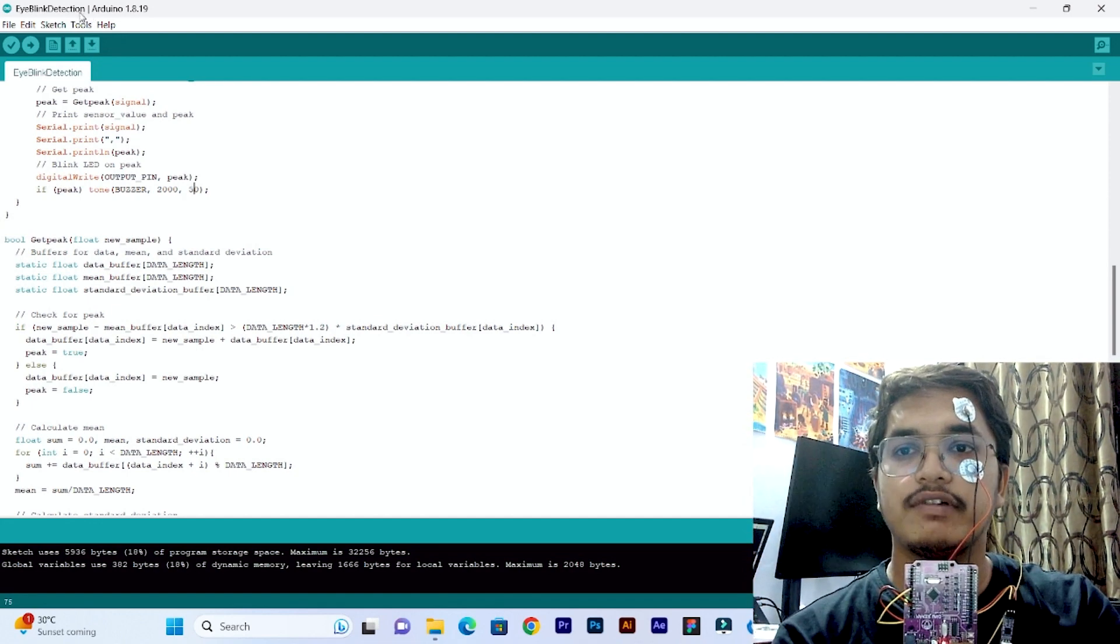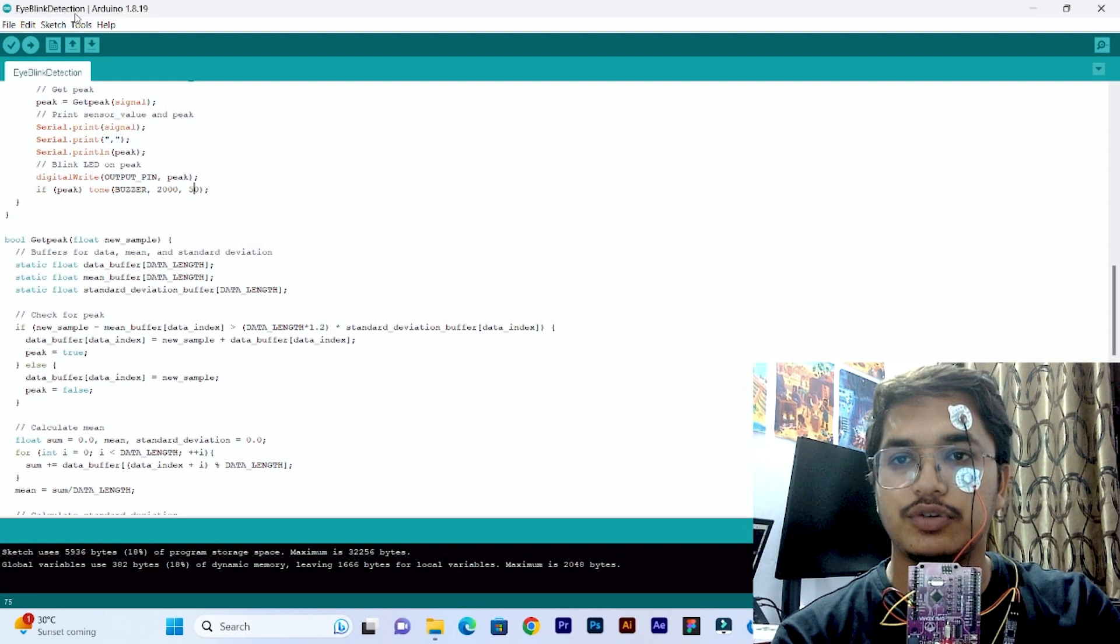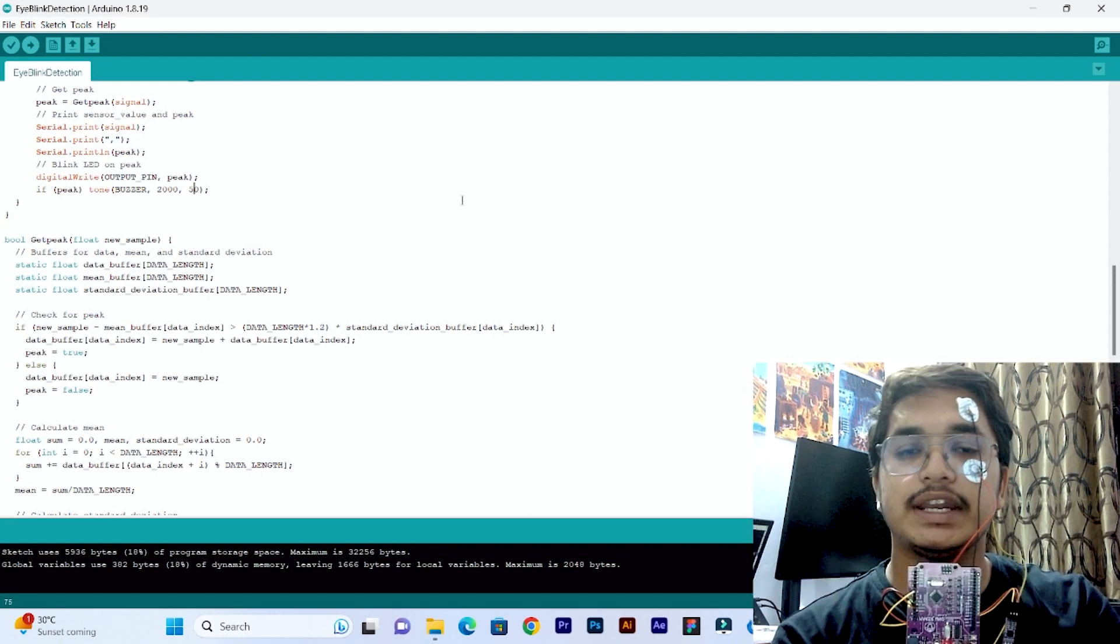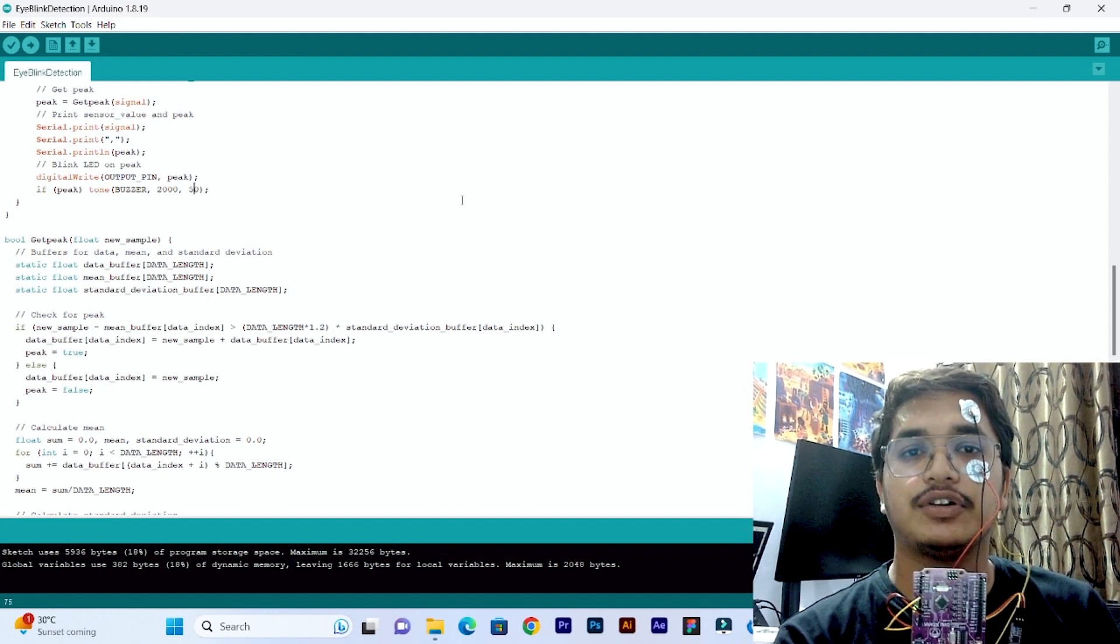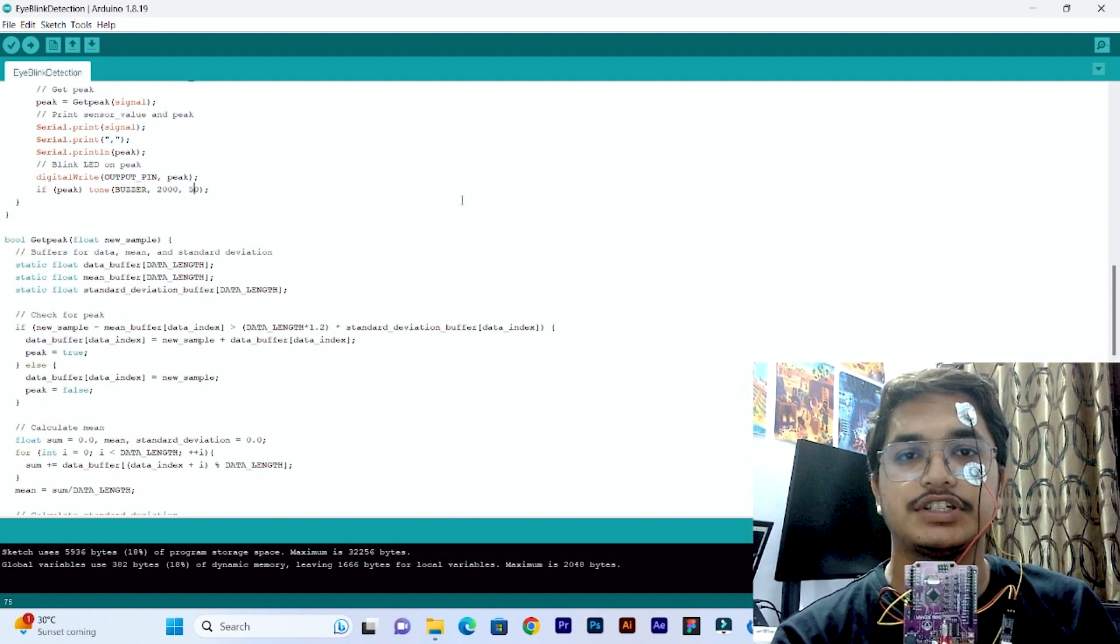Now we will flash this eye blink detection code which you can easily get on the GitHub repository of Bioamp EXG Pill.